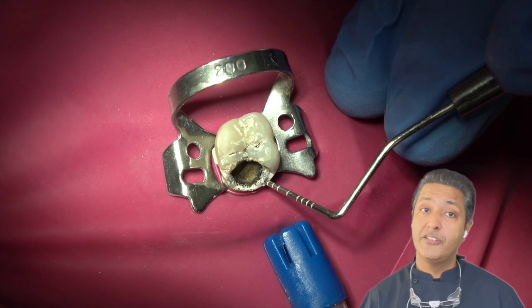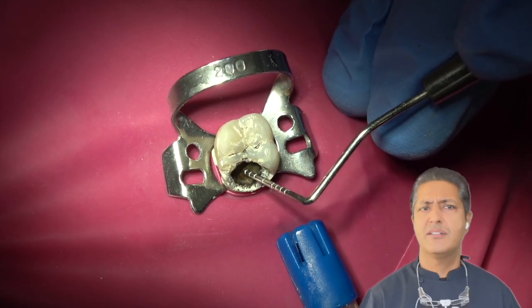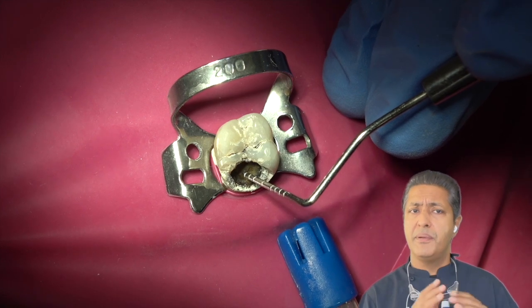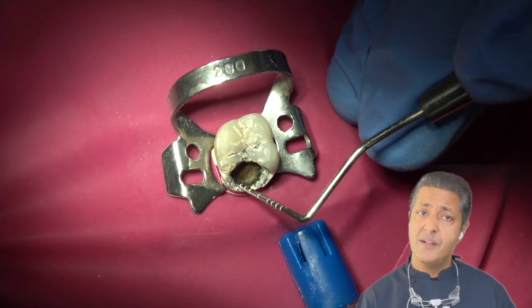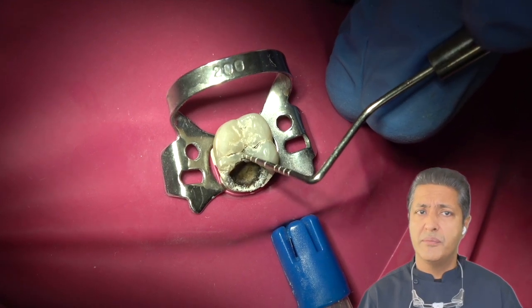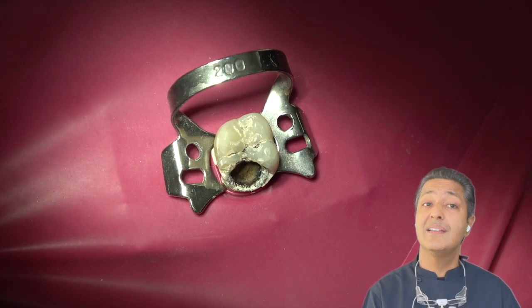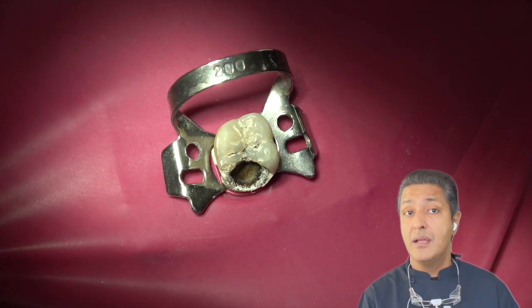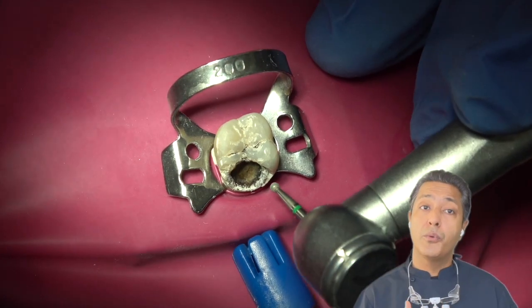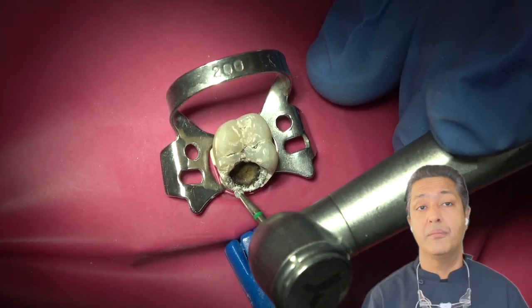We as clinicians are often in a hurry to jump into the pulpal space, whereas there is no need to do that. The patient is under local anesthesia and under rubber dam, so there is no need to hurry. It's always better to start with peripheral caries excavation first, because we need to provide a healthy environment to the tooth as we move towards the pulp.